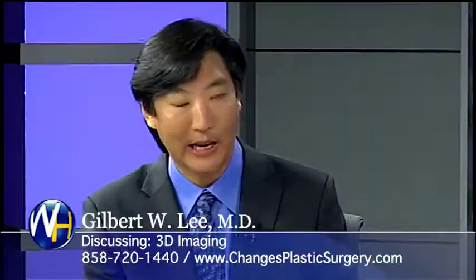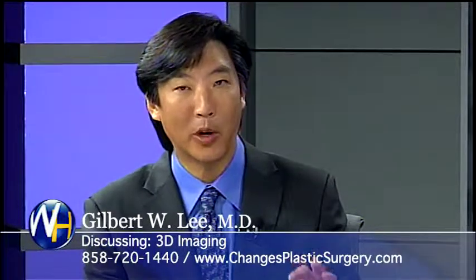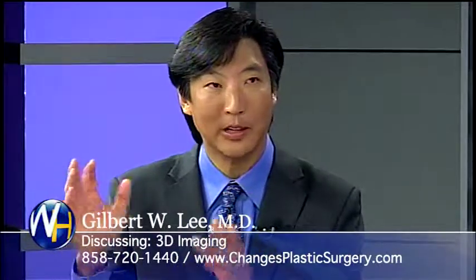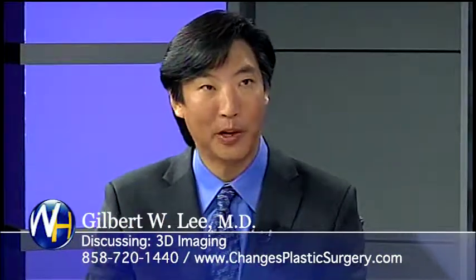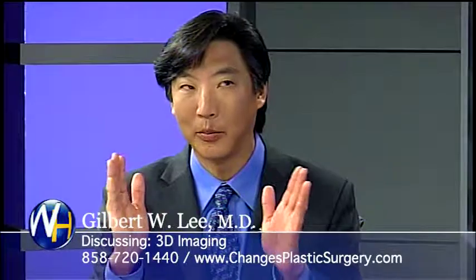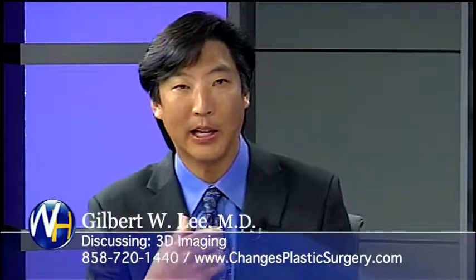So on a nasal surgery, rhinoplasty, or a facelift, you can show them predictably this is what you're going to look like. Yes, absolutely. And more importantly, I get the patient's input. I like to show them an example and say, now, what do you think of that? And if they say, I want the dorsum down a little more, the hump off, I want the tip up, show me with a skinnier tip, it allows them control over their result.